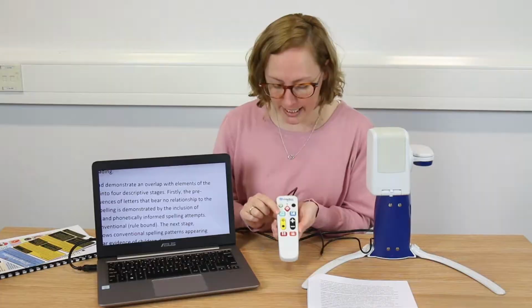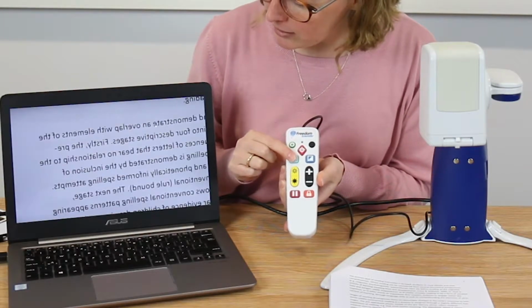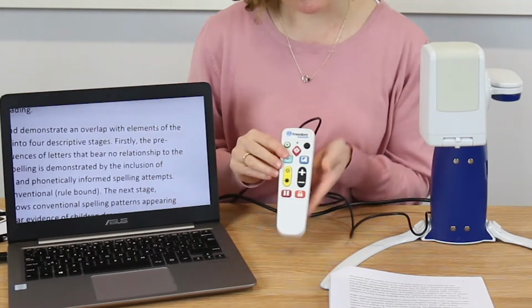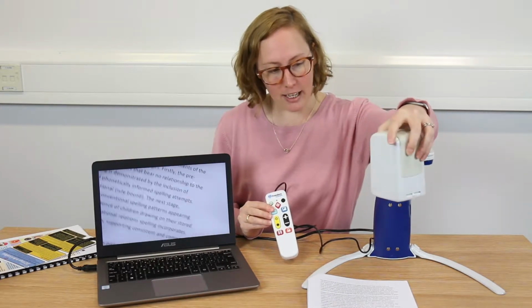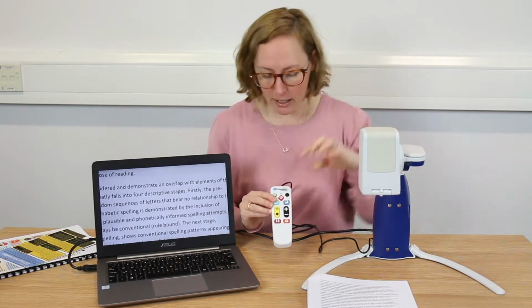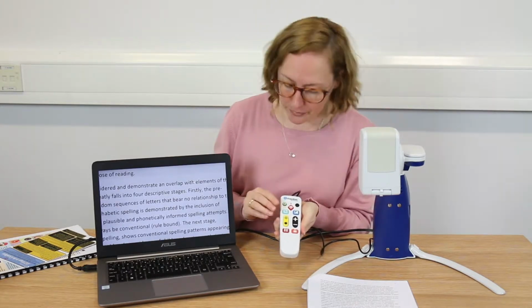We also have a rotate button, which is just here. If you press it once, twice, 3 times, and 4 times, it's just going to cycle through rotating the image, mainly because the camera here, as you rotate the camera, it's going to rotate the image. So that means that you can rotate things around to get them the right way up.